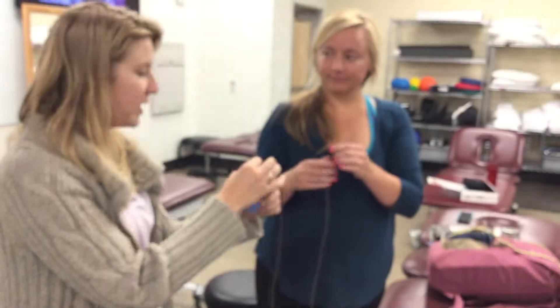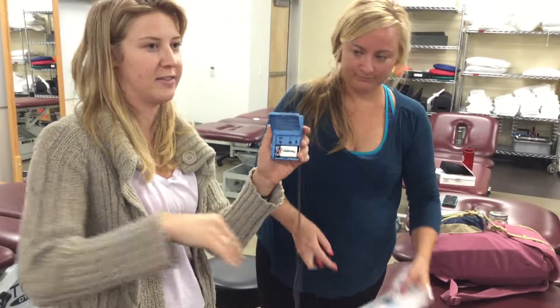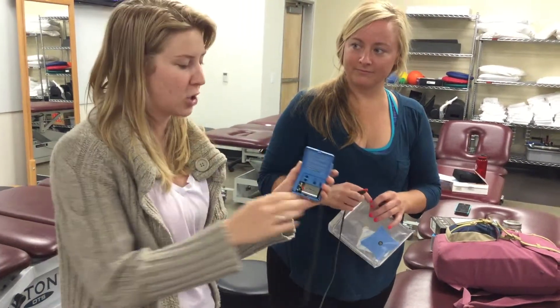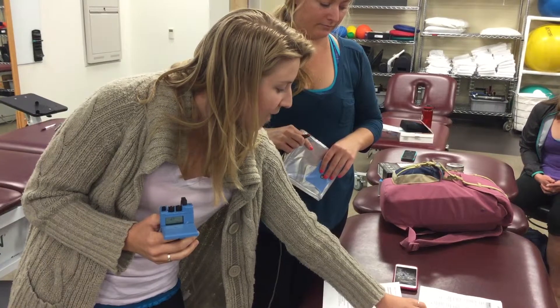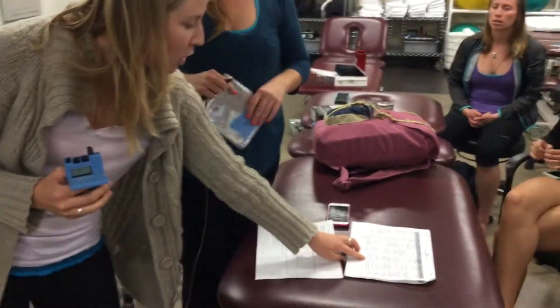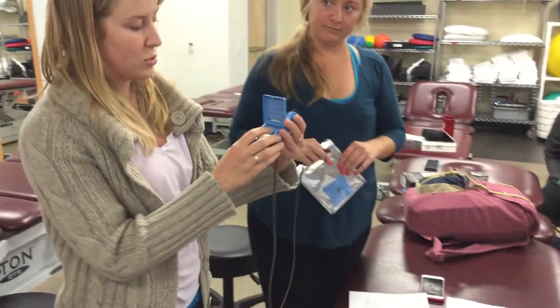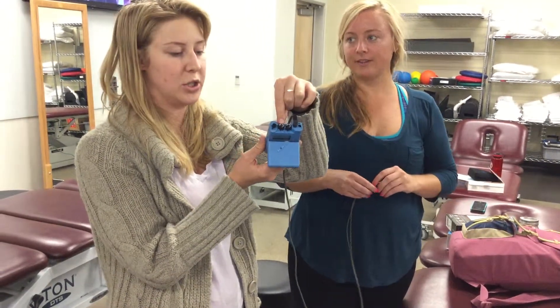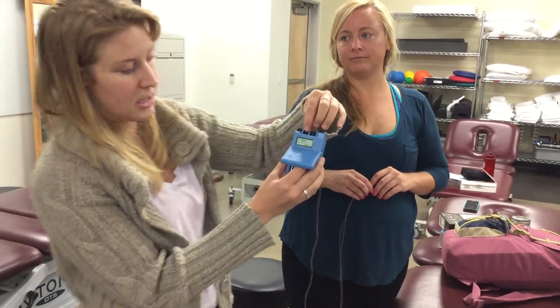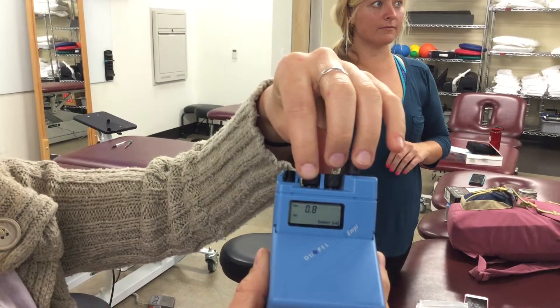Once you have it on 40, you go from S1 to set the dosage — you're going to go to P. P means pause, but you can also think of it as pre-start. On that sheet, look under pulse or phase duration: if it's a cathode or anode, it'll tell you the dosage. Because dexamethasone is negative, we're going with cathode 0.5. You can change that by turning this first knob here — it says channel one on it. Right now it's at 0.4, so you can change it up or down to 0.5.